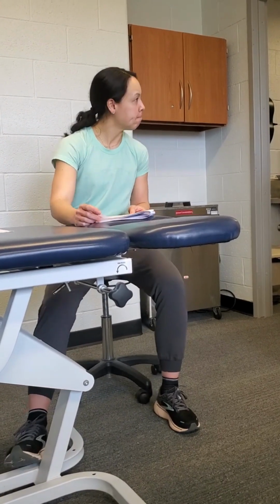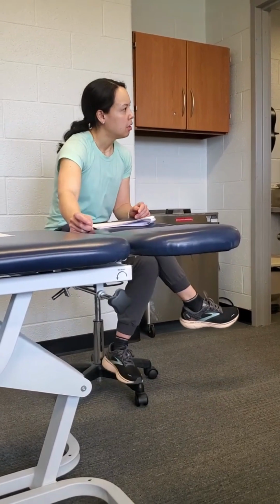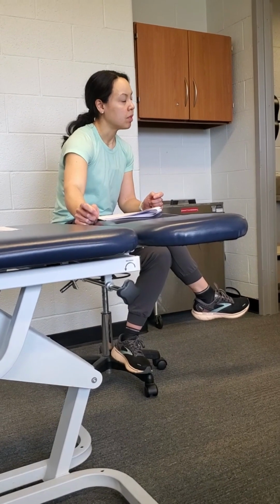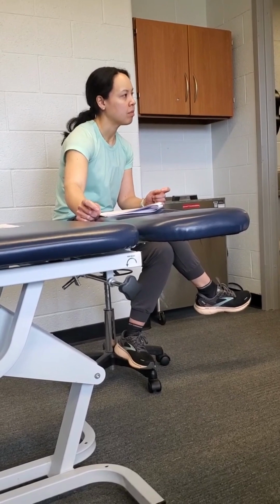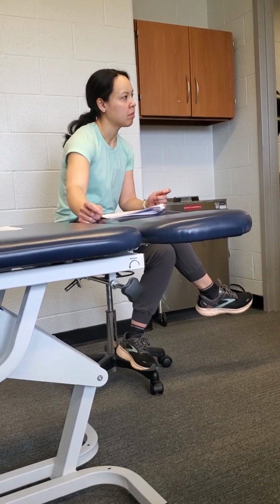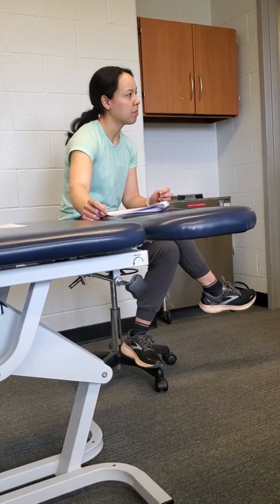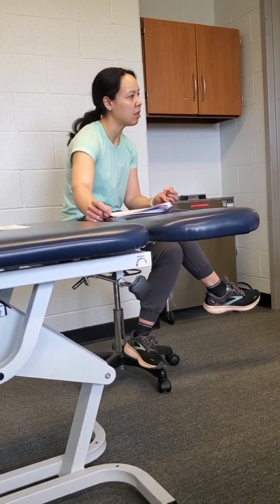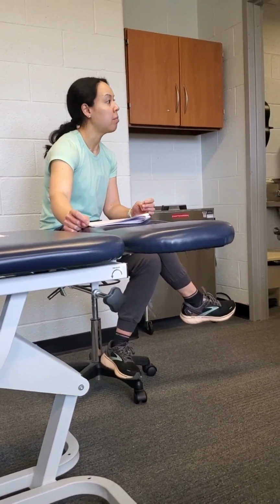And this probably goes back to the other articles that you noted, like the importance of reducing edema and the pain response, which is why they're bringing it to a lot of OA patients. The central sensitization that's occurred with the OA, lasting for years and months, for people, this is almost acting like a gate theory to some degree, creating a hypoxic painful state to trigger the system to use descending inhibition for the pain.